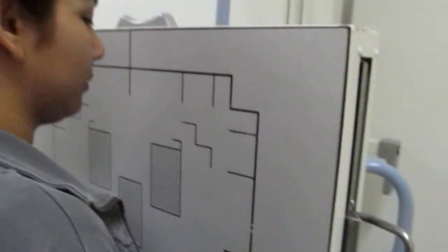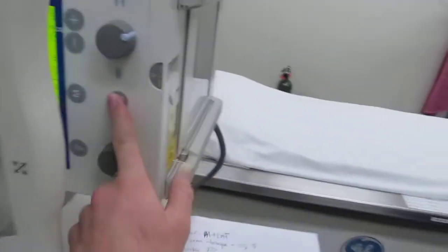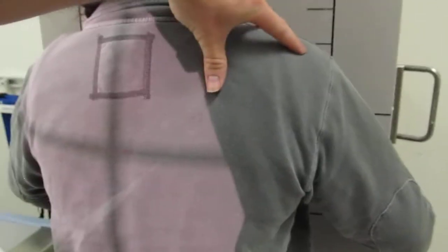Okay, I'm going to position my patient. So could you stand closer to the board with your body against it and your arms to the side, kind of hugging the board. And here's my marker. Left marker is going to go right here. Okay, let's get her positioned correctly. Get her centered. Move you slightly over to the left. That's good, just right there. Please try not to move.